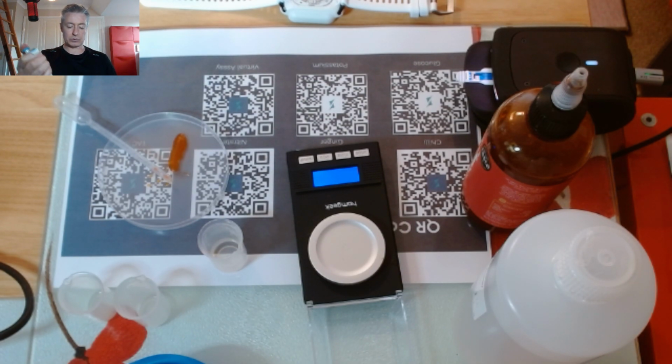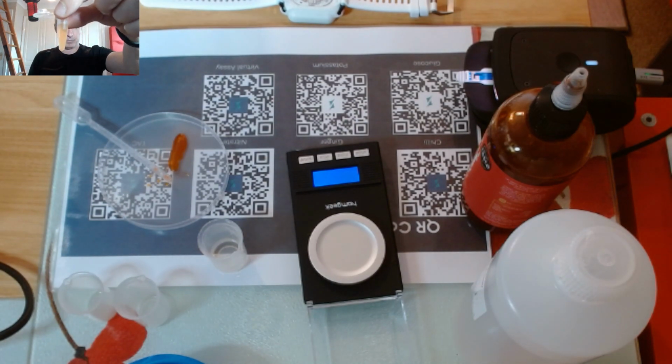You'll see us drawing blood in real time, because even blood is a very messy little sample, but the kind of science that we use means that we don't need an awful lot of filtration and centrifugation for it to work. So at this point, I've prepared the sample. It doesn't matter that it's cloudy, by the way. Electrochemistry or electroanalytical sciences don't really care about that.